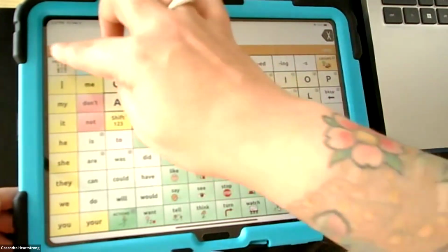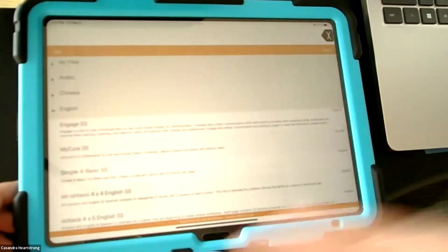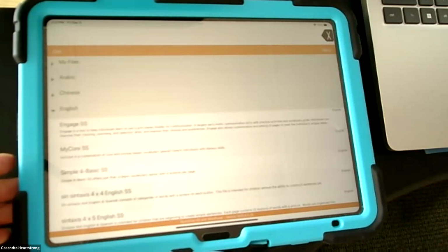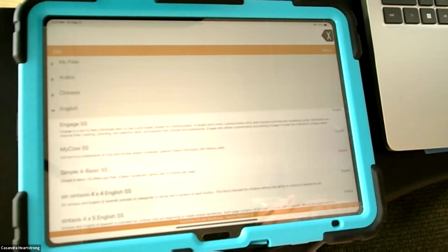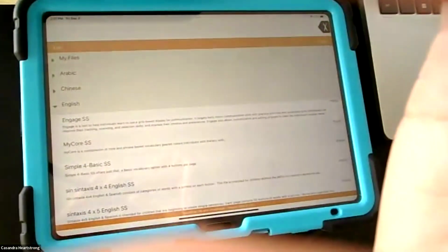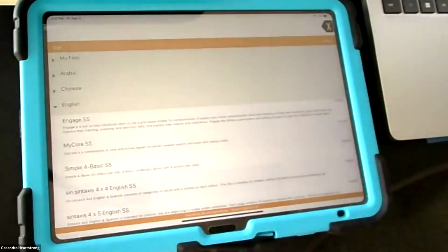within the TouchChat app. There's also within the TouchChat app, and I'm going to pin this so everybody can see me big. Let's see. Spotlight. There we go. I think that's probably, did that help? You see it better? I'm not sure about the image quality, but okay, let's do this. We are going to video settings. Yeah, that's better. Working with technology, talking about technology. There we go. Okay, that's a little bit better.